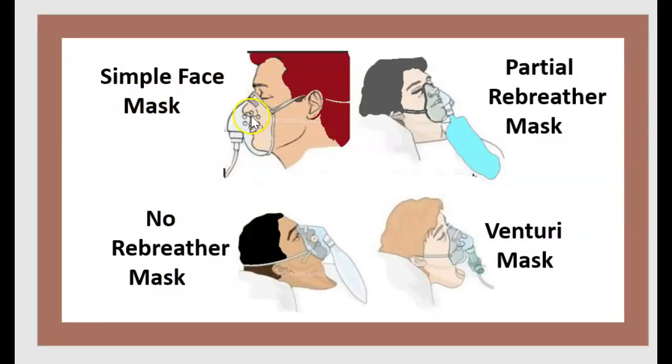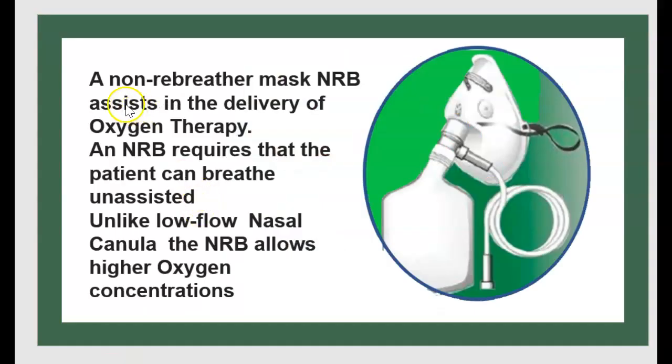Simple face mask, venturi mask, non-rebreather mask, and partial rebreather mask. A non-rebreather mask, NRB, unlike low-flow nasal cannula, allows higher oxygen concentration.